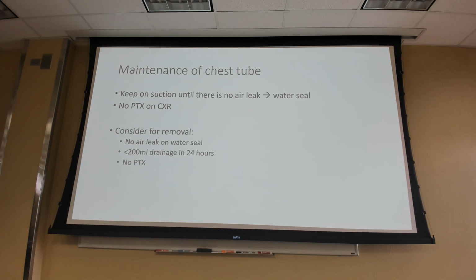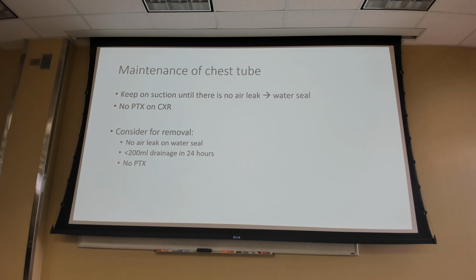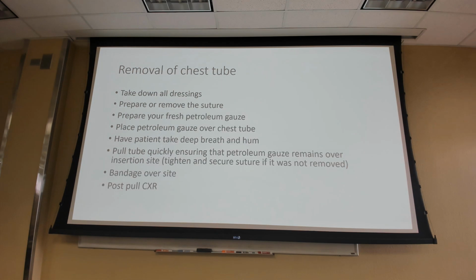So we don't have to do any more procedures on that patient. That's why we tie it that certain way with the Roman sandal. One is to keep the tube in place so we can avoid any displacement. But the other is so we can close it up afterwards as well, and we don't have to do another procedure. We don't have to re-anesthetize the area for sutures, okay? The video will show you that, and we'll practice that at our live tissue lab.